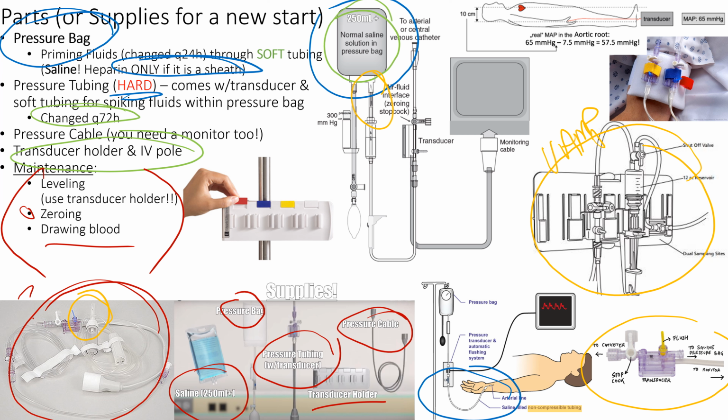So here's the patient over here, right? So here's the patient right here. We're going to pull all the blood in here. It's going to fill up with blood, fill up with blood, fill up with blood, and then we attach our syringe and draw our sample. Instead, before, you have to wipe the port down, you have to draw back your waste, discard your waste, and then attach another syringe, and did you wipe it? I don't know. And then you have to pull back your sample, discard it, and then you have to flush it again. It's a whole process, right? So it's easier when we have the vamp in place as well. Okay.